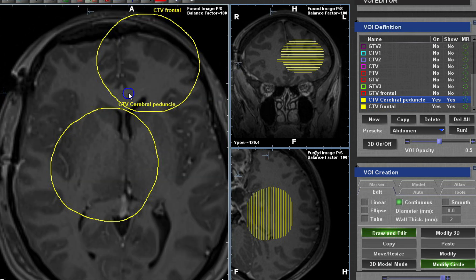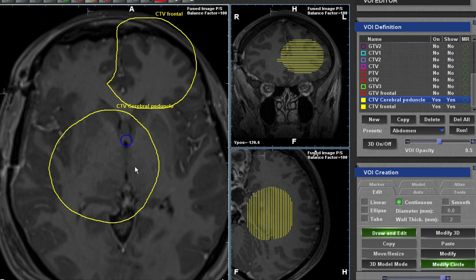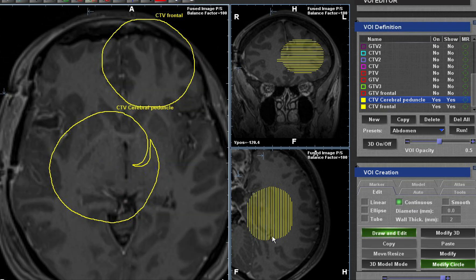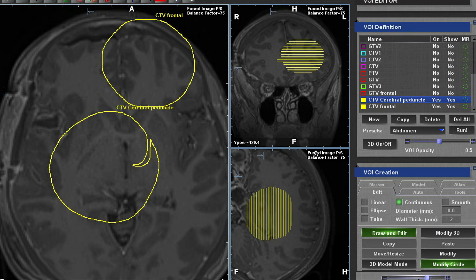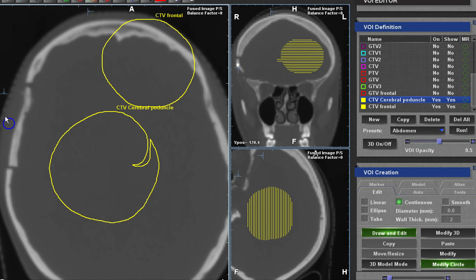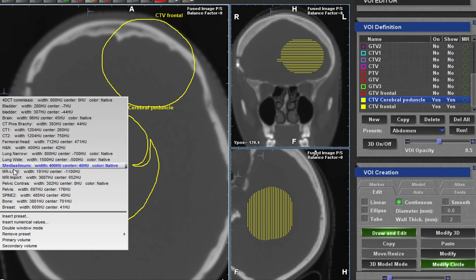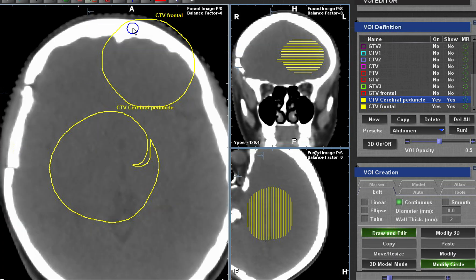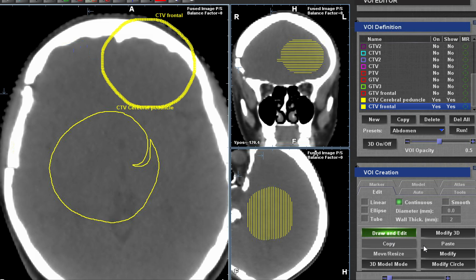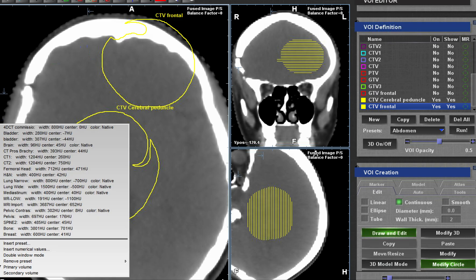To summarize: tentorium cerebelli, falx cerebelli, don't forget the corpus callosum and its splenium, and don't forget the anterior and posterior commissures at the level of the third ventricle — none of these should be trimmed. One final important point: if your PTV is three centimeters, please do not trim your CTV on the normal window when trimming near bone. If you have the brain drawn automatically via auto-segmentation, you can ask your physicist to handle it.